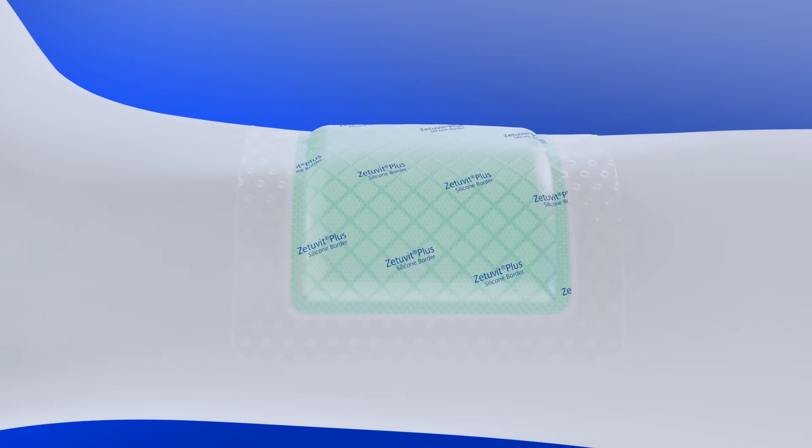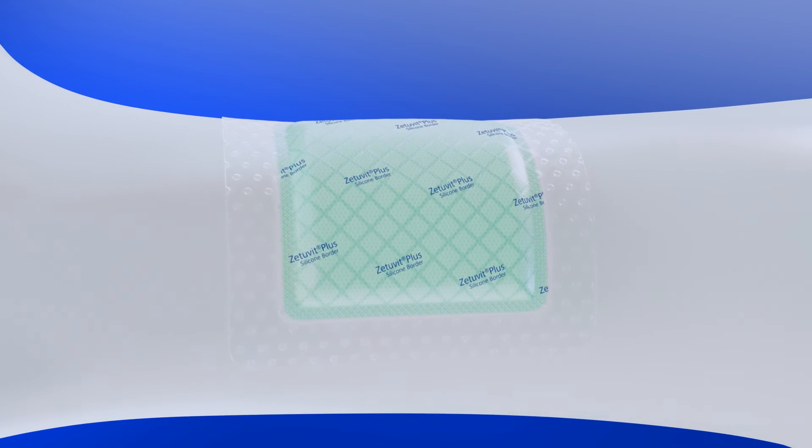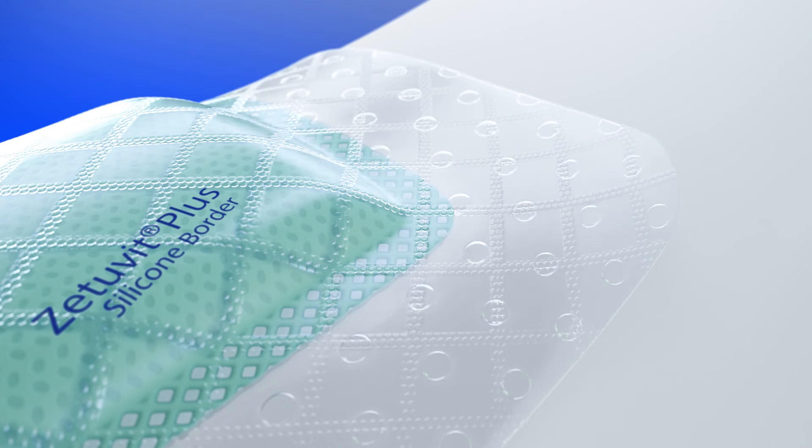The transparent backing is highly breathable and at the same time bacteria-proof, virus-proof and waterproof. The specially designed silicone contact layer allows atraumatic dressing changes as well as repositioning of loosened edges.